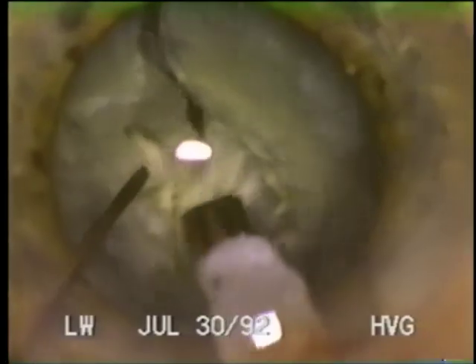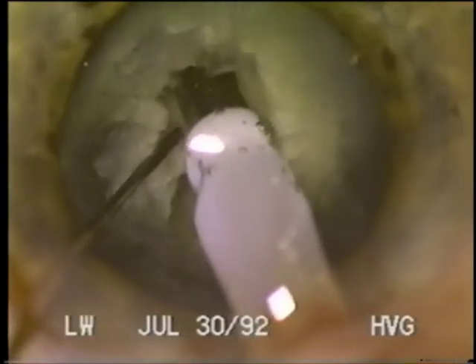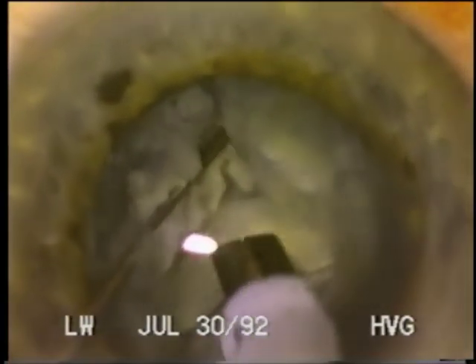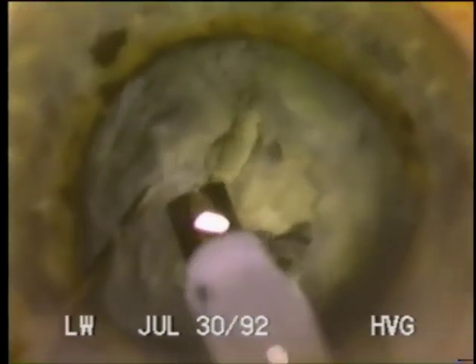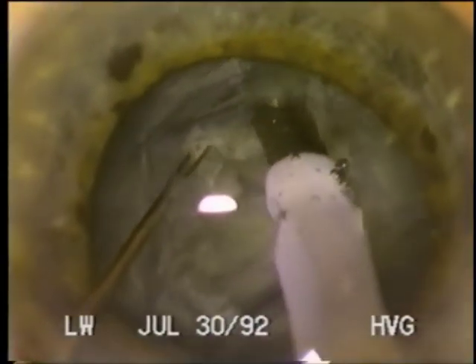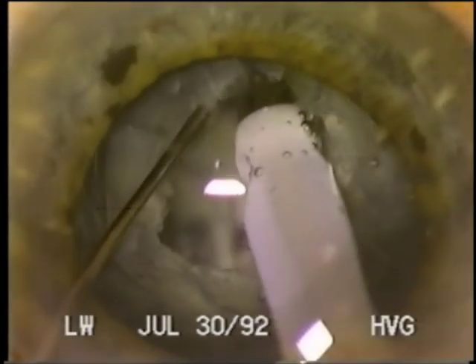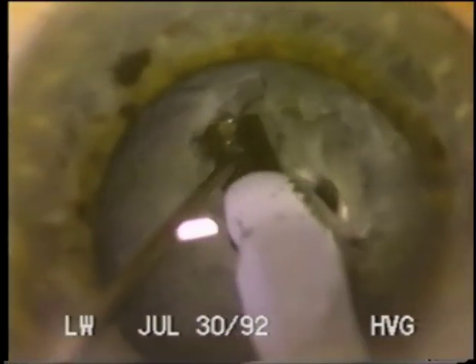Especially in these dense, mature lenses, it may be necessary to reposition the tips further superiorly to crack the posterior plate as illustrated here. As before, the second fracture is made by rotating the lens clockwise, and with a burst of ultrasonic power, the tip engages the nucleus. Using the second instrument for stabilization, a fracture is obtained through radial cleavage planes isolating the segment of the nucleus. In softer lenses, I make four or five fractures in the cataract material. In these denser lenses, however, six, seven, or even eight sections are made for more manageability due to the difficulty of handling large, dense segments.